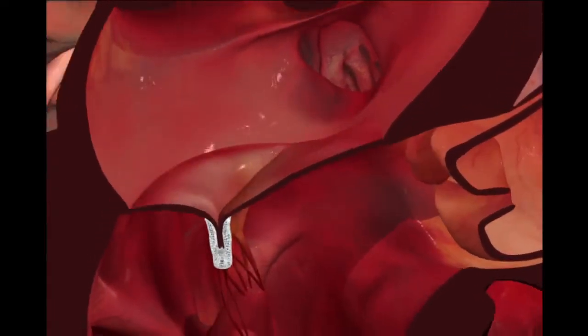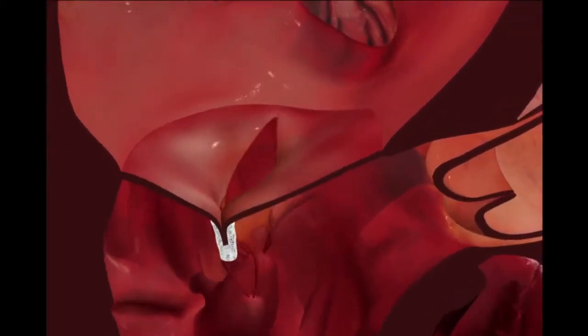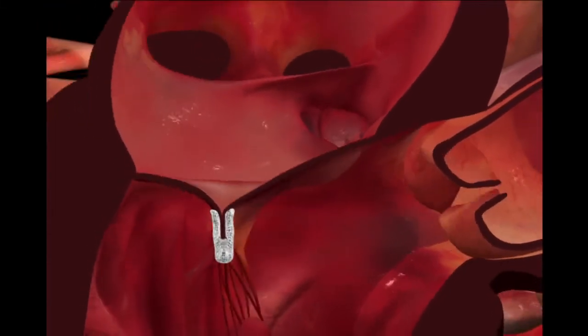Securely attached to both leaflets, the clip moves with the valve, allowing blood to flow through each opening. The mitral valve is repaired without open heart surgery.